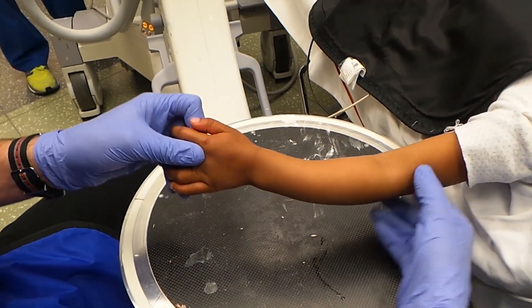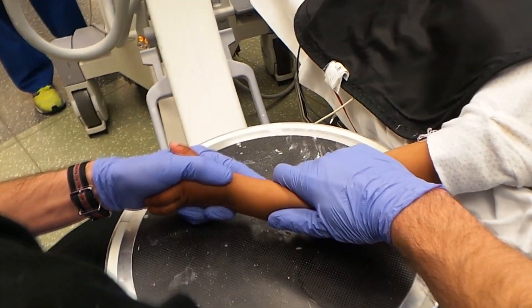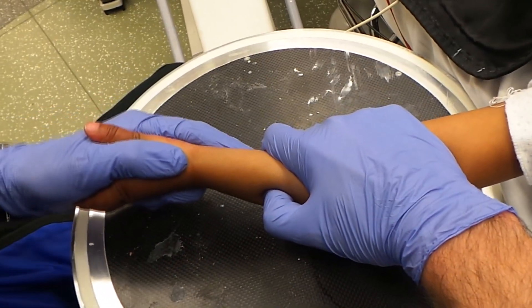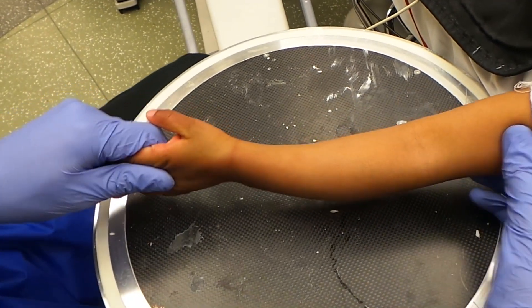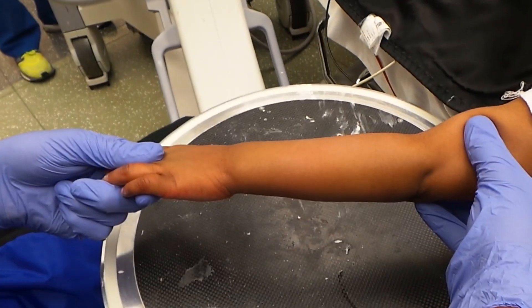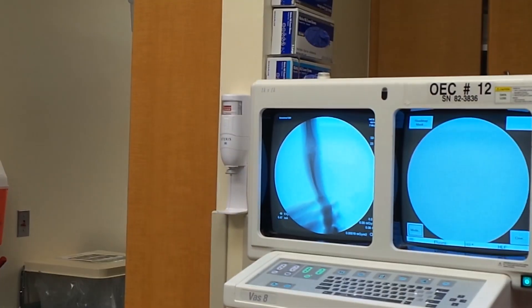So primarily apex dorsal deformity. Just going to give it a little push. Taking pictures under fluoroscopy. There's a tiny amount of residual deformity we'll try to make better.